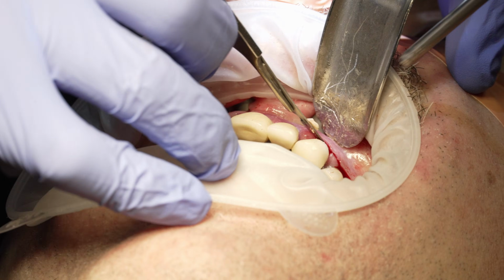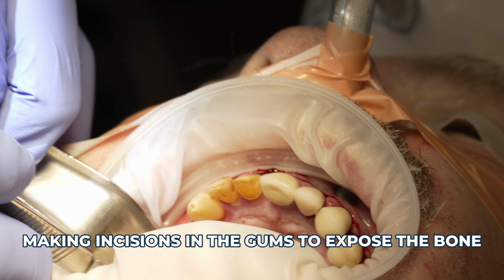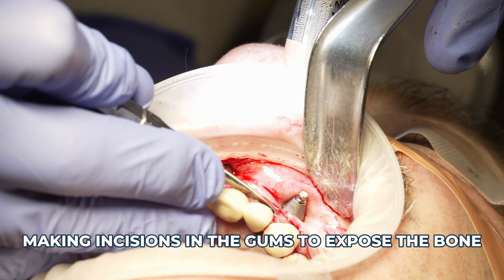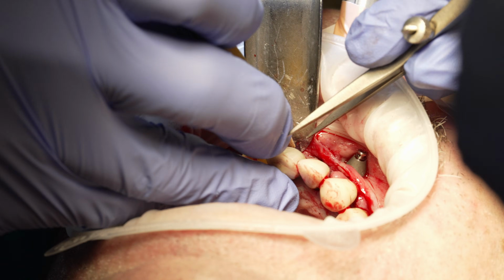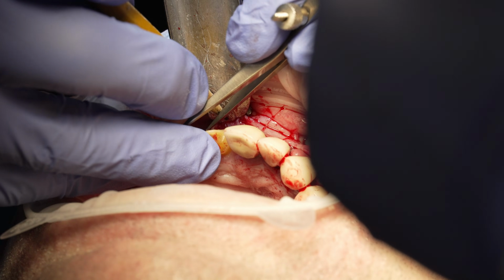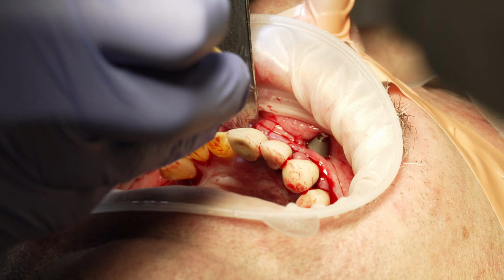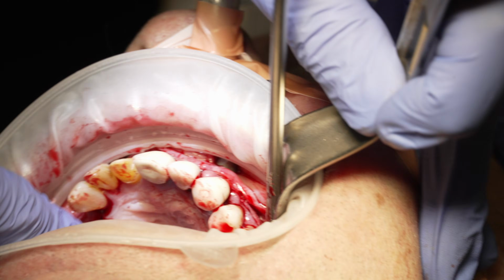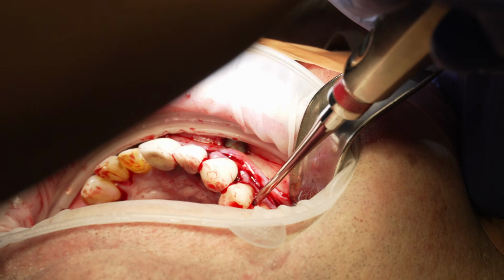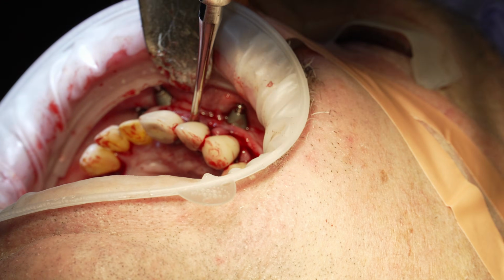Now that we've taken that scan and we've lined it up in the mouth, we start to make incisions and start pulling back the gums to expose the underlying bone. And this is all done with the teeth still in place. So now this next part might look a little funny, but just in case this guide that we made fails, we still have planned how far down we would generally need to drill the bone. And so the oral surgeon right now is marking with a sterile pencil on the bone where we need to drill down to, just in case the 3D guide just does not work at all.